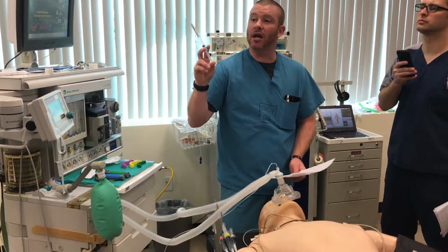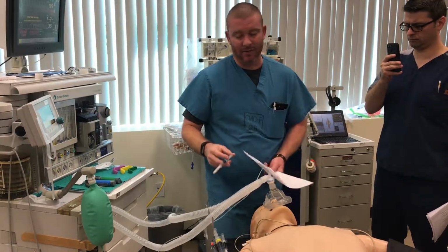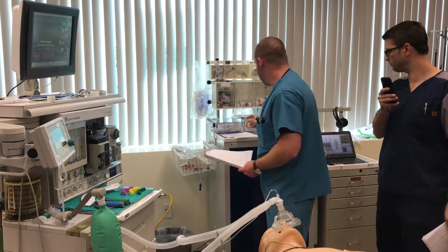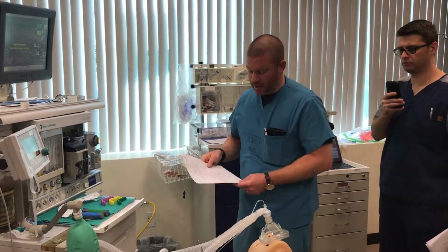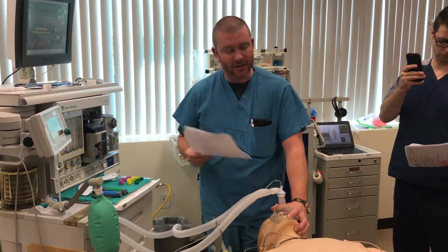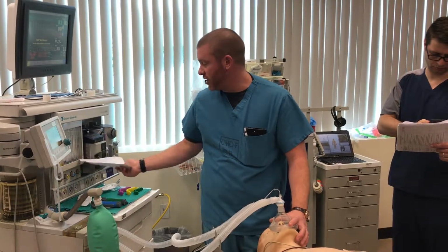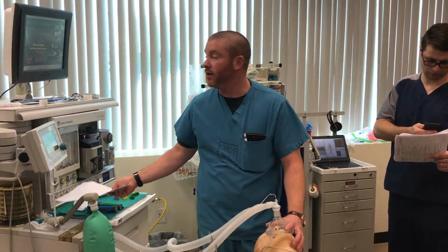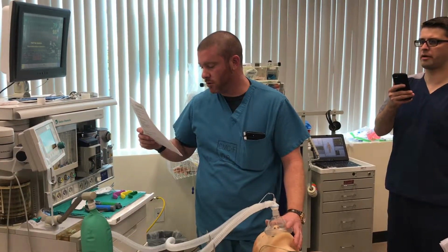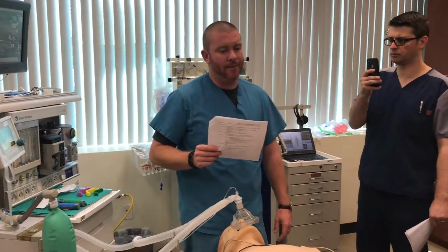And I give my narcotic immediately after the Versed or the first induction drug. It's the next drug to come in sequence. So I would give him 150 micrograms of the fentanyl right after my timeout. And my anesthesia timeout, that I just got out of order here, would be that I'm making sure that he's being pre-oxygenated, 5 liters with an APL that is open. All of my monitors are ready to go. What else? And I'm in bag mode. My vaporizers are off. Everything is good to go.